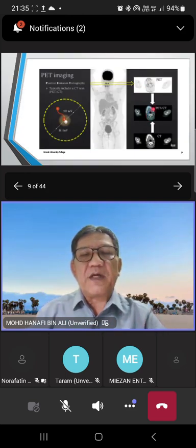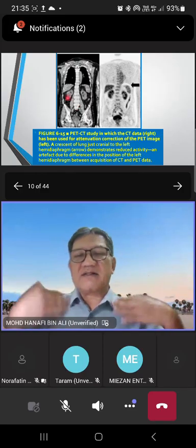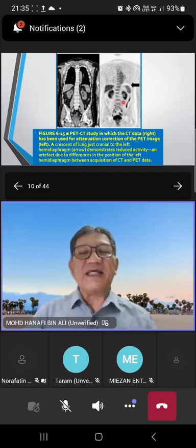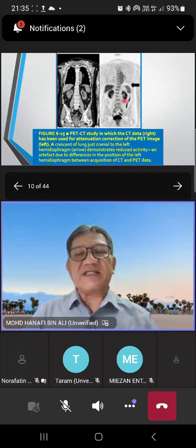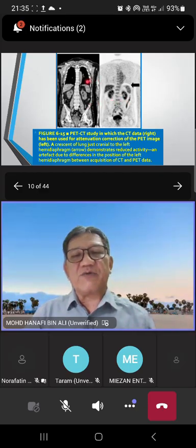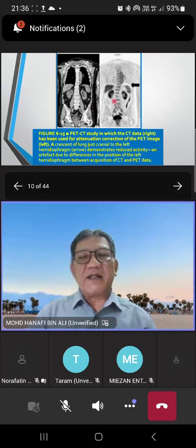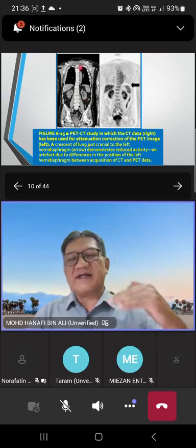This is the image from CT, and when you look at it like this we call it a coronal plane. Yeah, we cut it slightly sideways, but this is not originally how we can get this image. This is not MRI. With MRI we can get any plane of the body, but for PET CT we normally do axial.